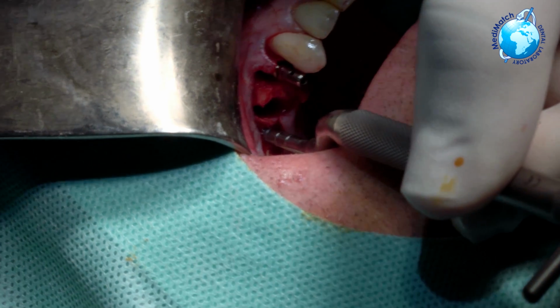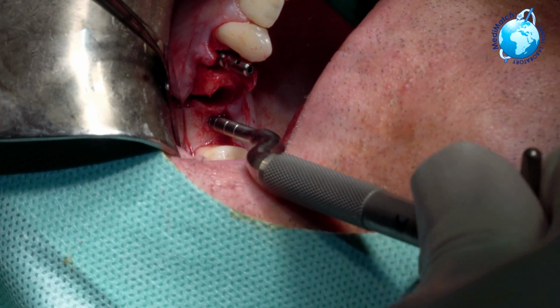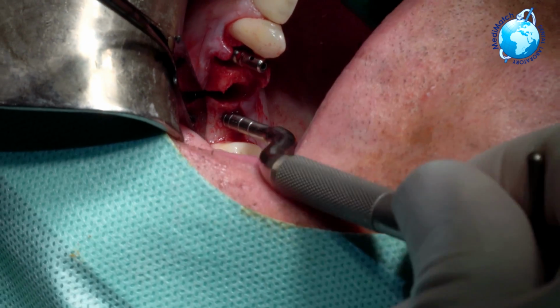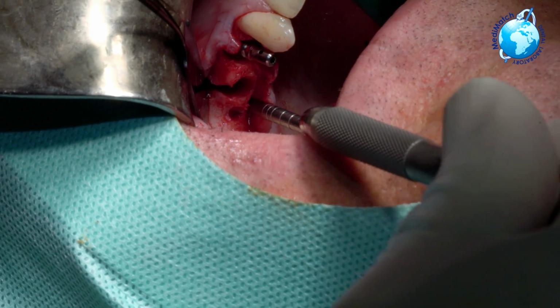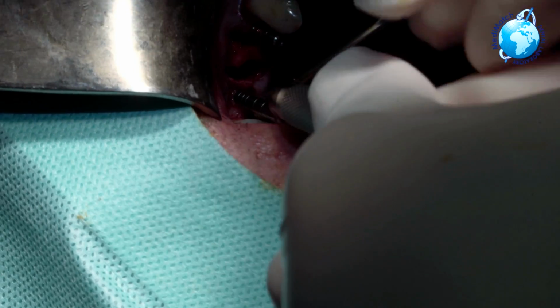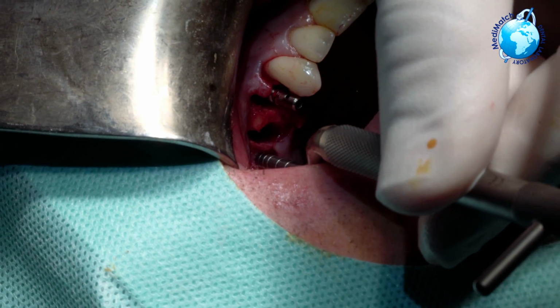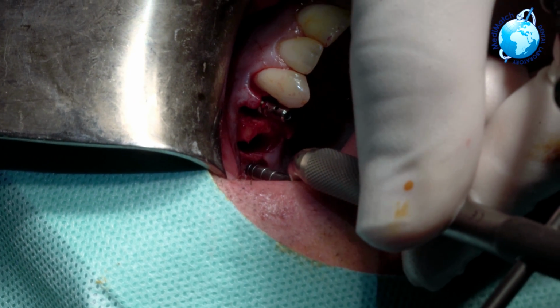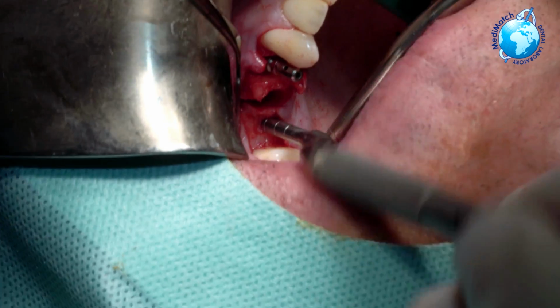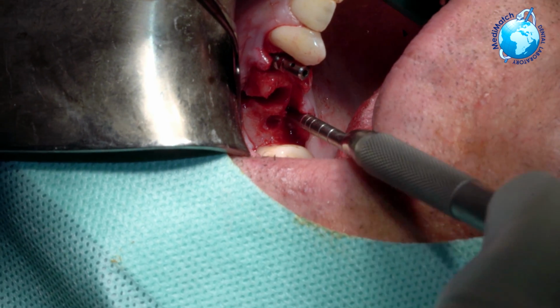Crack open the implant. Okay, so that is solid Scottish bone there, Alan. Look at that. Yeah, you're good. Suction. Okay. That's the sinus lift done. Beautiful. Just going to relax that out.